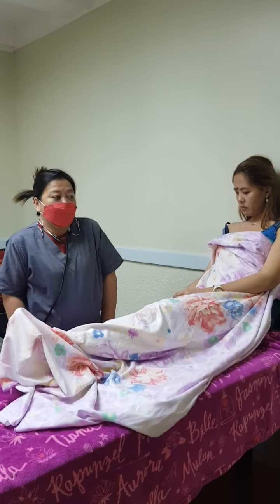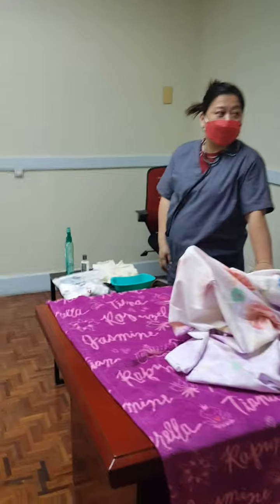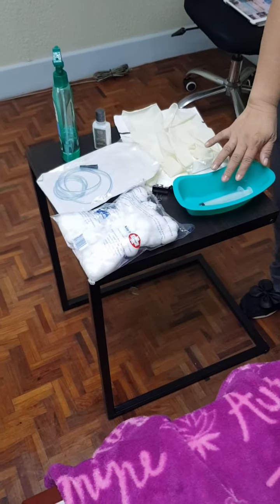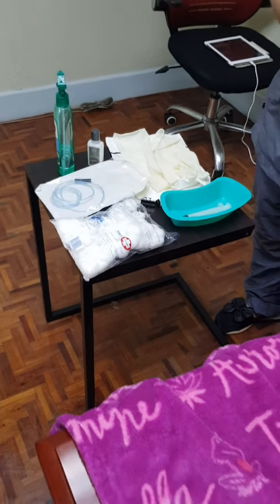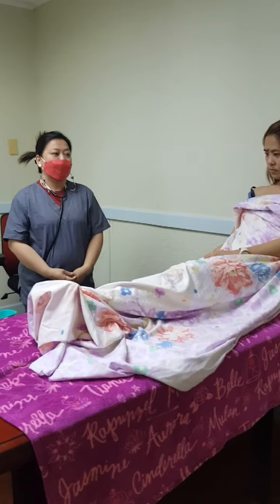Equipment required for NGT are the nasogastric tube, syringe, lubricant, cotton balls, kidney tray, adhesive tape, stethoscope, clamp, marker pen, steel tray, and disposable gloves if available.